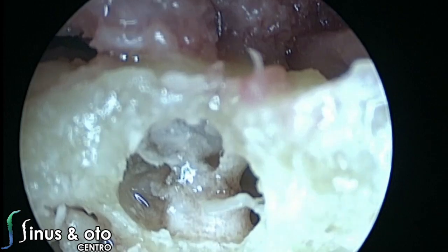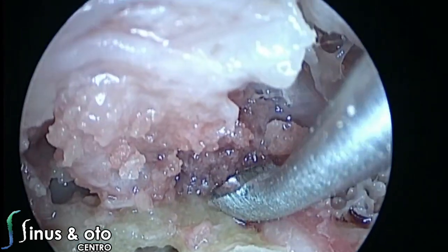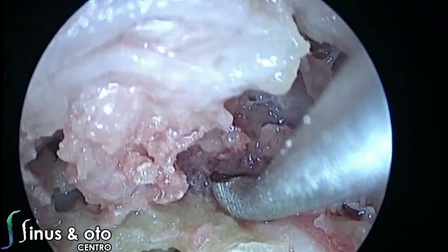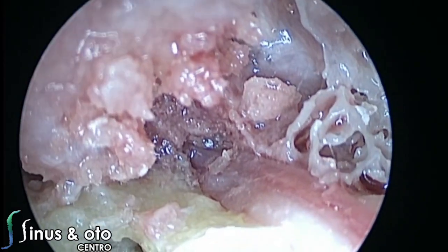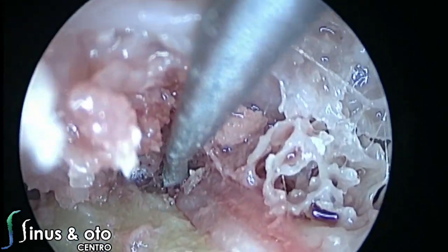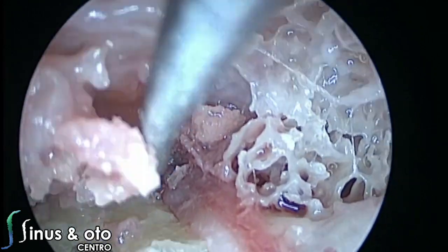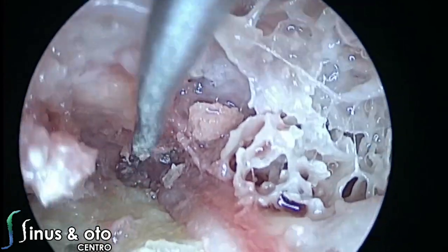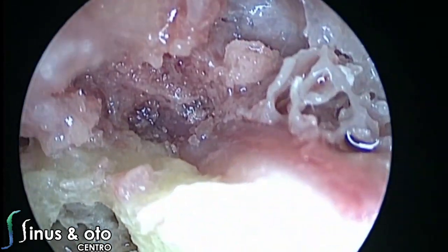So this is the geniculate ganglion where the facial nerve goes inside, and if we go a little bit more anterior, following the tensor tympani muscle, we can find a smaller branch that comes from the geniculate ganglion, which is the greater petrosal superficial nerve, or the GPS nerve, GSPN. So we curette a little bit more in this anterior way, and then we see a small branch of the nerve going and following the pathway of the muscle in the direction of the eustachian tube. So when we open this, we can see this greater petrosal superficial nerve going inside.